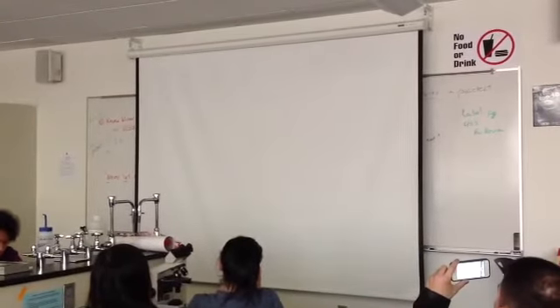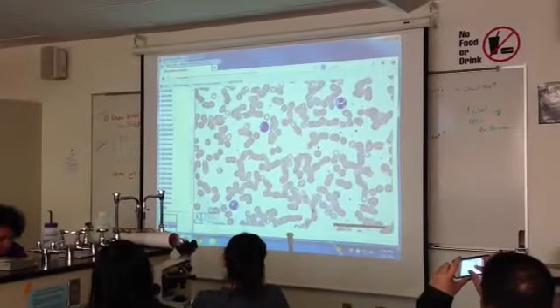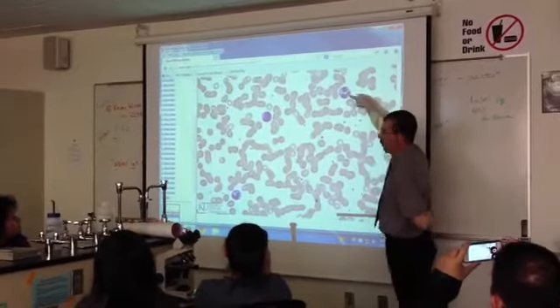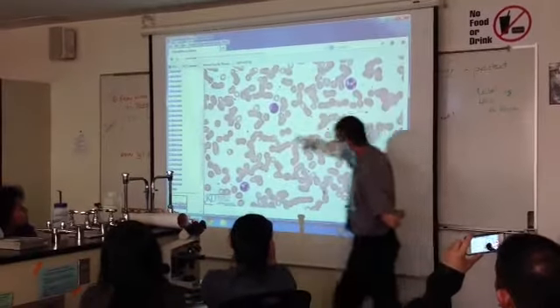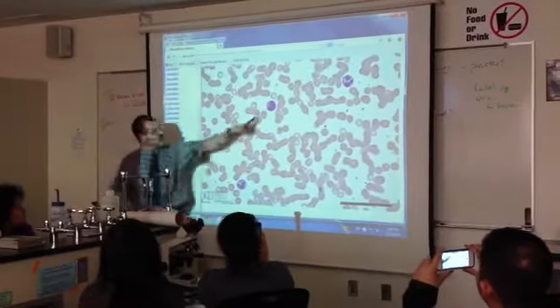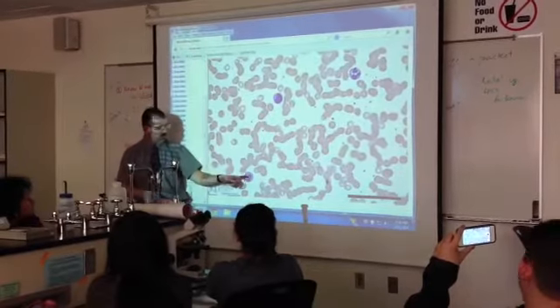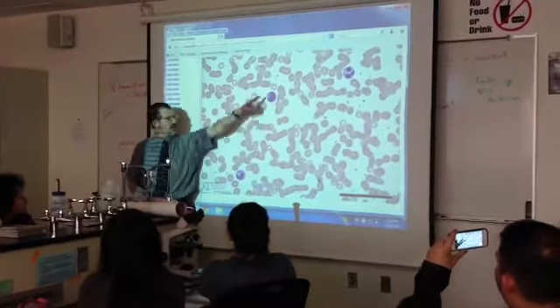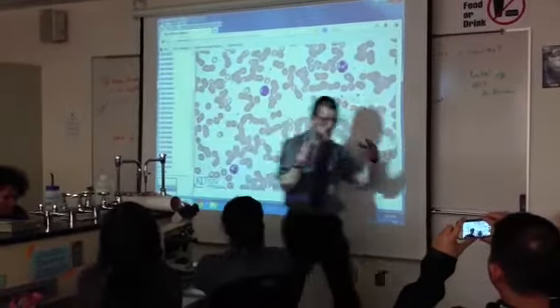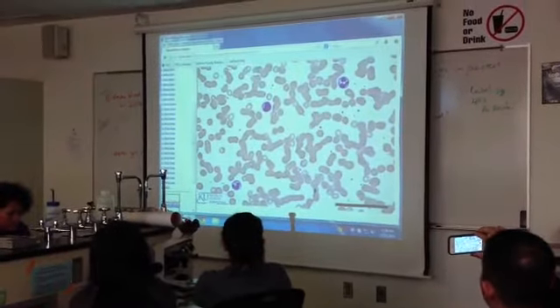What about the other cells? Let's try those. Let's go back to this picture. Okay, let's do this guy in the upper right. Neutrophil. This one down here. Neutrophil. Exactly the same. This one, the lymphocyte. Those are the most common ones. Neutrophils, multi-lobe nucleus. Maybe you see speckles. Lymphocytes, all going to be dark. Very little cytoplasm. Those are the 2 most common ones. So if you keep claiming you see a basophil, I'm going to laugh because you don't.